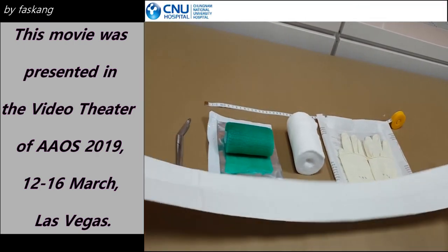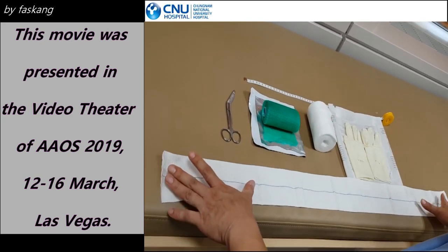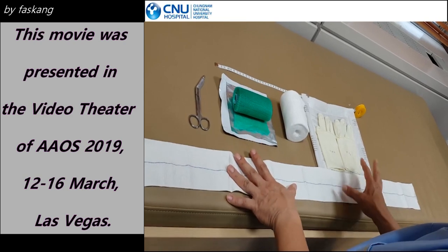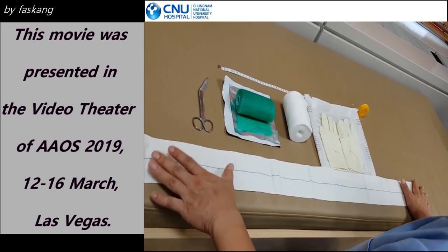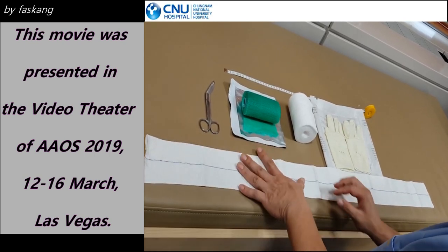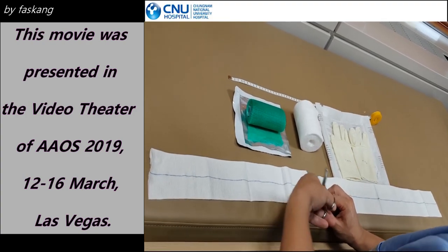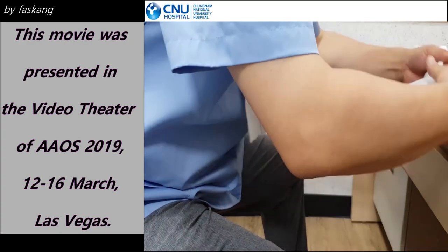These are the materials for making the open-heel short leg cast. A one-meter long elastic sleeve is cut into two pieces, each 60 centimeters and 40 centimeters long. The longer sleeve is applied on the distal portion of the lower leg, and the shorter sleeve on the foot. The sleeve is applied in two layers.